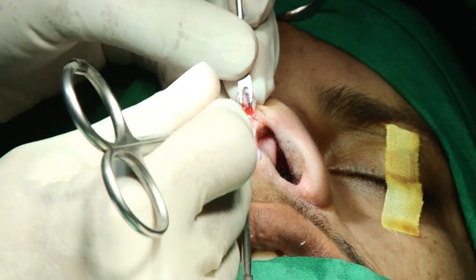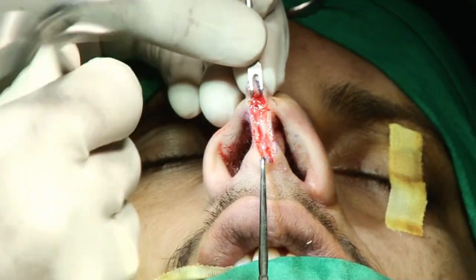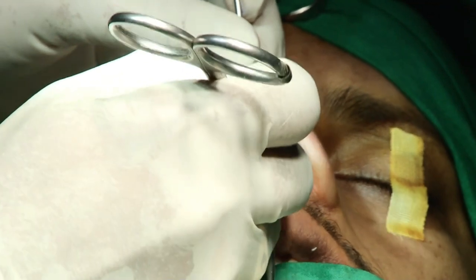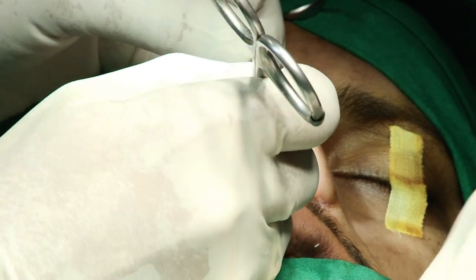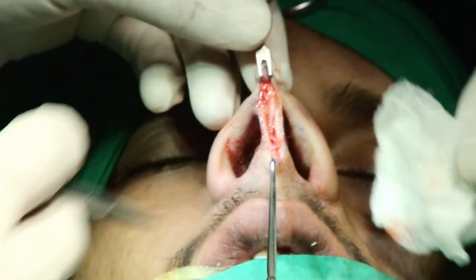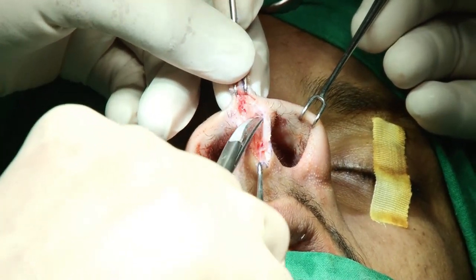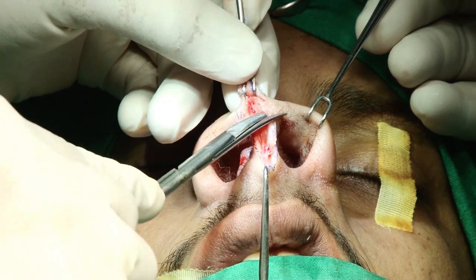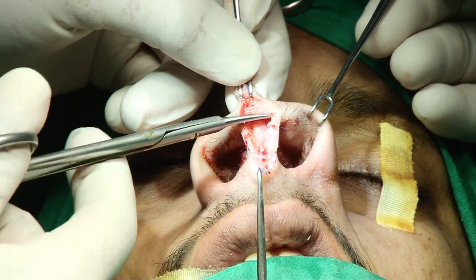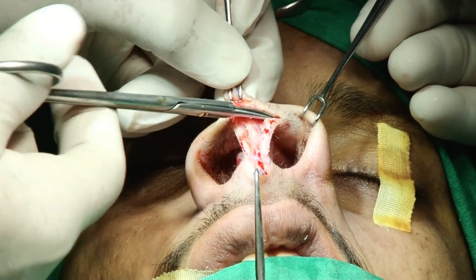So this is the margin of the right side of the medial crus. I first secure the margin of the medial crus of the right side, this one. And then this is the left side. So first you secure your margin of the medial crus. This is my left margin, and this is my right side. Now for further dissection, just go along the margin, like we discussed in the cadaver. This is the advantage when you first make the transcolumellar incision.